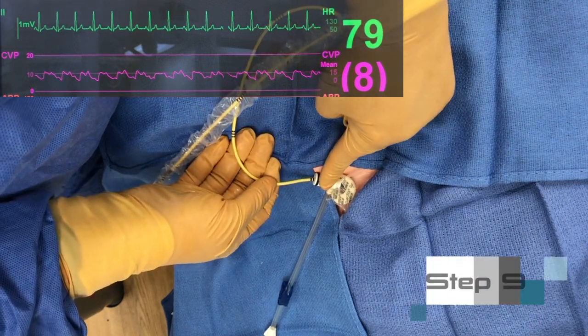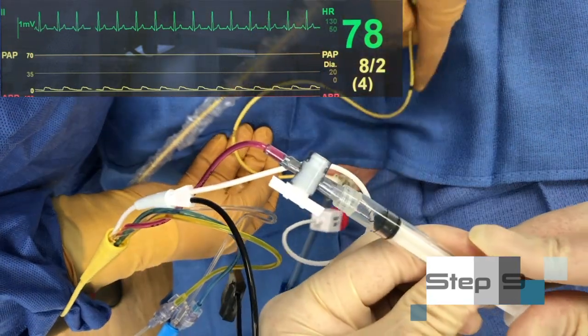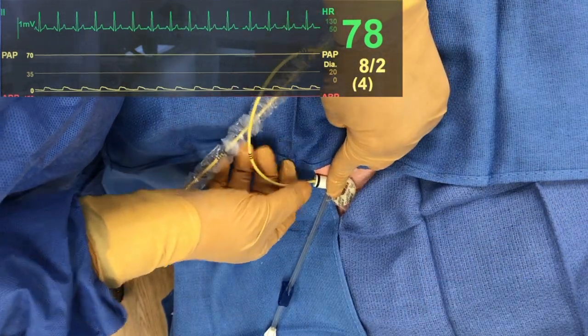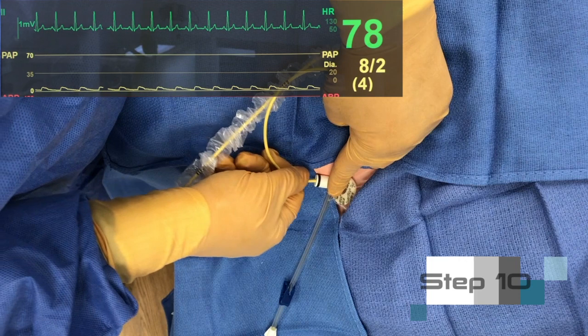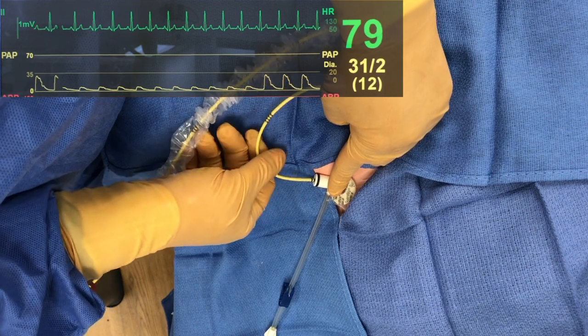Step 9. Instruct the assistant to inflate the balloon by stating balloon up. Balloon up. Observe the pressure waveform tracing as you slowly advance the catheter. Step 10. At approximately 30 centimeters, the catheter tip should enter the right ventricle. This is confirmed by a sudden increase in systolic pressure.